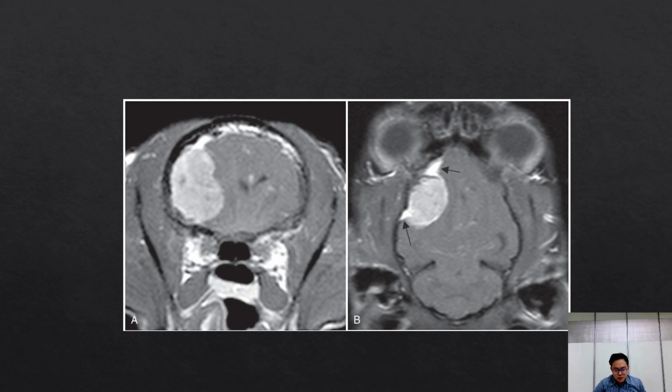There's a cat that had seizures, behavior changes, and has been acting aggressively lately. This is an MRI image of a cat's head, and you can see this irregular lesion that doesn't make sense in the brain. So that might be a brain tumor in this cat. You can get a lot of information just without even involving the pathologist by doing clinical and imaging examinations.